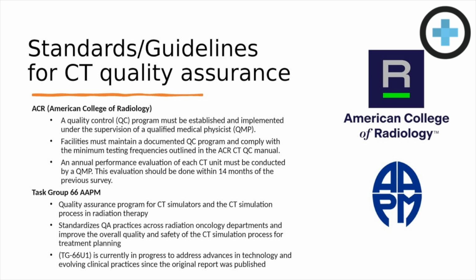And then Task Group 66 is a quality assurance program for CT simulators and CT simulation for radiation therapy. It standardizes QA practices across all radiation oncology departments and helps to improve the quality and safety of CT simulation processes. There's currently an update to TG66, looking to upgrade the original, so that is currently ongoing.